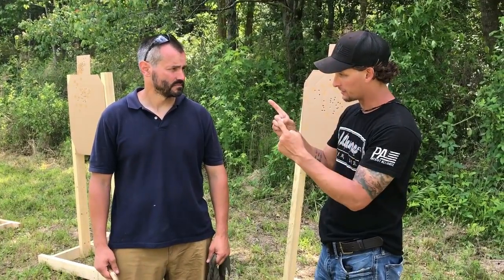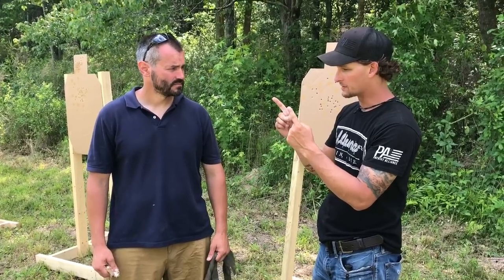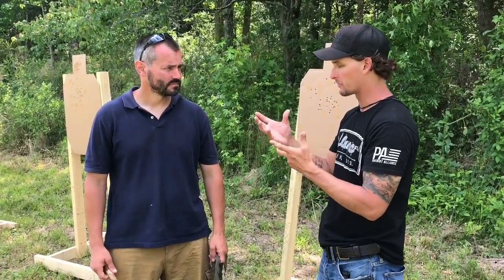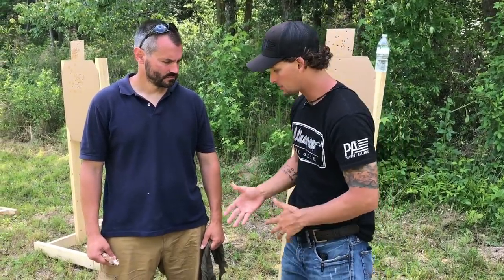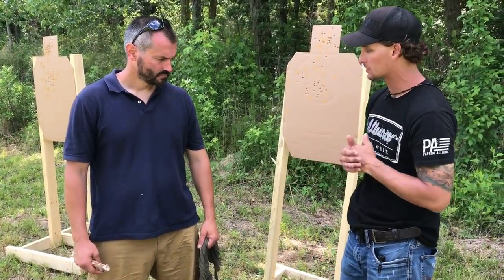A lot of people carry just one tourniquet. I think it's important to walk through the steps of what an improvised tourniquet is and how to make one properly. You can use me if you want to — go ahead and talk us through what you've got in your hands.